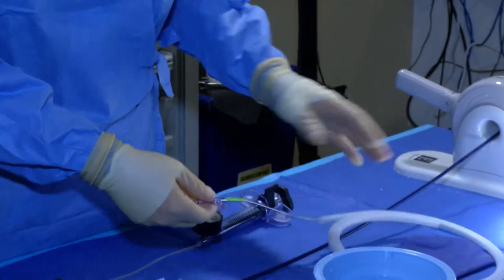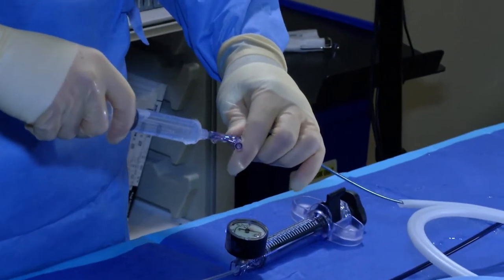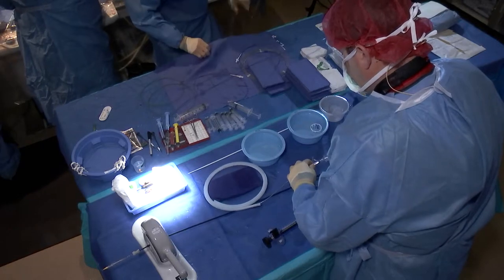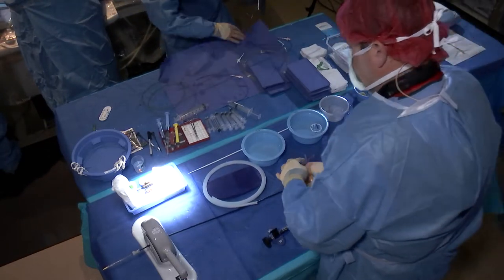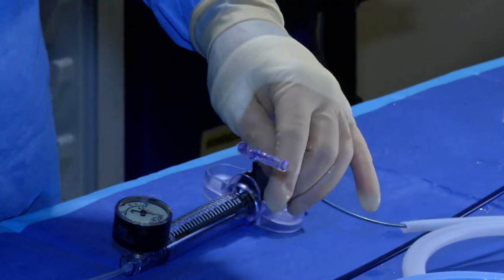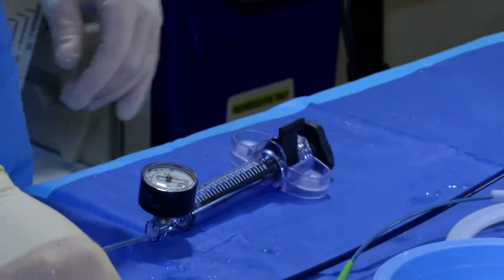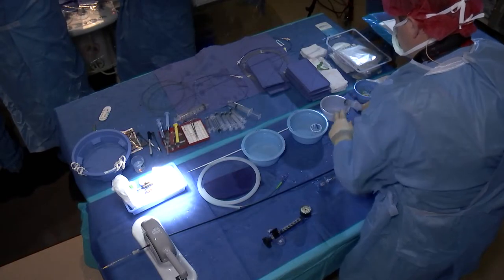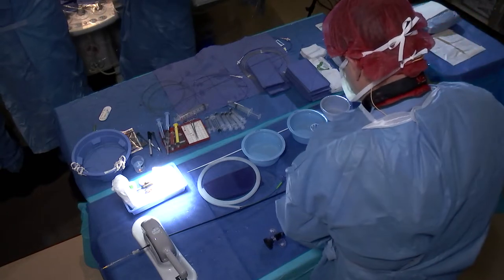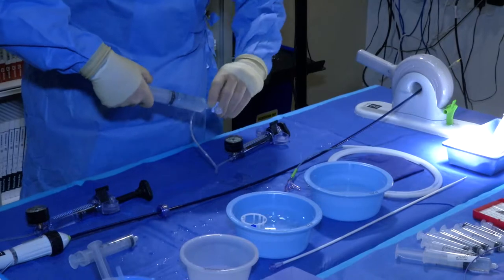This is the balloon that comes in our kit, the Edwards kit. We have four different sizes, just like the valve. So this is a 20 millimeter. We're using a 23 valve, so we usually use a little bit smaller balloon. Same thing, I'll just use a mix of contrast to fill up our inflation device.